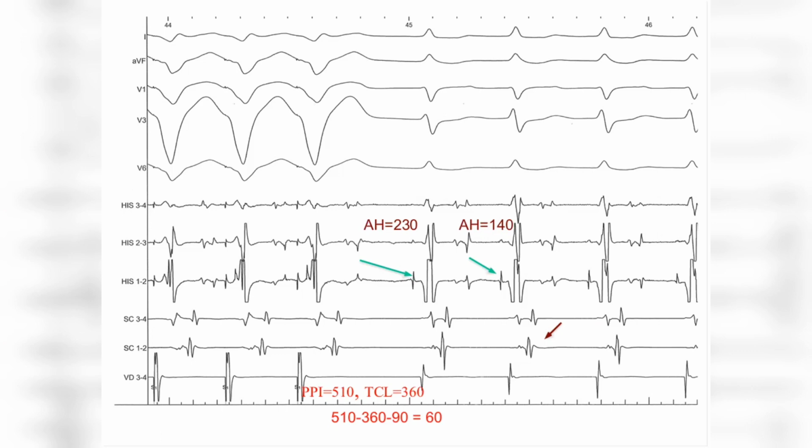As you can tell now, when we see all the tracings, the activation was eccentric. The tachycardia involves a left-sided accessory pathway. You can easily tell now. But if you didn't have a coronary sinus catheter as in the previous tracing, then this maneuver could have been of great help. Also, if you measure the VA interval during pacing here as compared to the VA interval during tachycardia, you get about the same result, a 60 millisecond difference, which goes very much in favor of accessory pathway-mediated tachycardia.